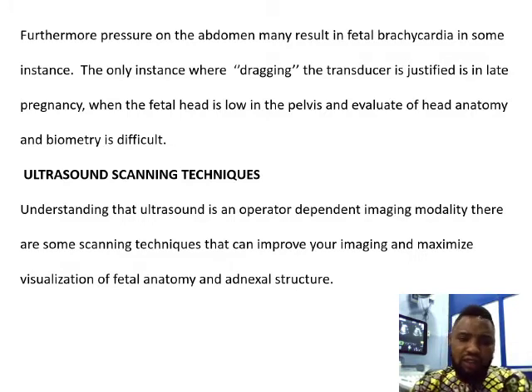Ultrasound scanning techniques. Understanding that ultrasound is an operator-dependent imaging modality, there are some scanning techniques that can improve your image and maximize visualization of fetal anatomy and adnexal structures.